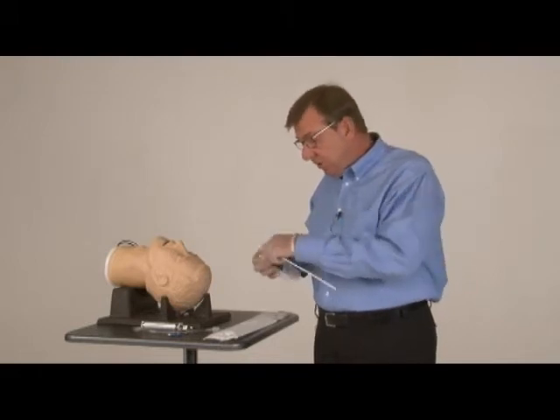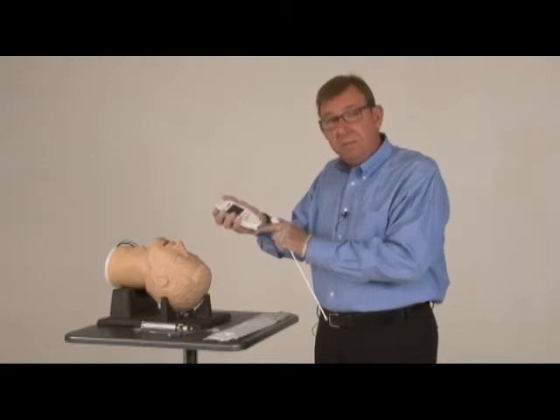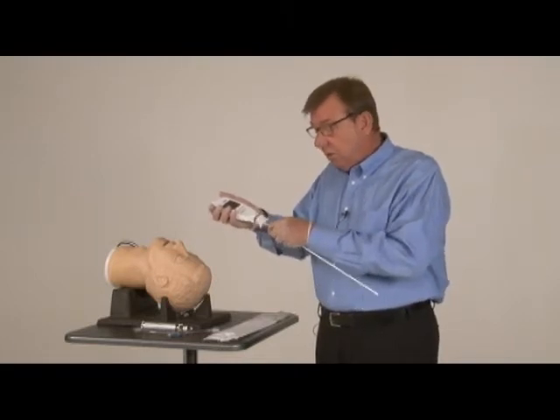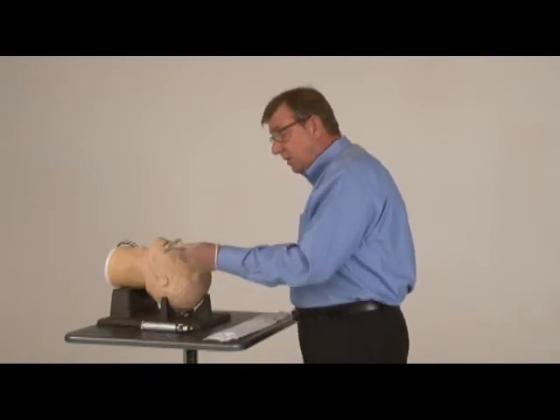To use it, you attach your stylet to the handpiece. There's a nipple and a hole in the back of the handpiece that'll allow you to orient it correctly, and you just snap it together and then insert it into your ET tube.